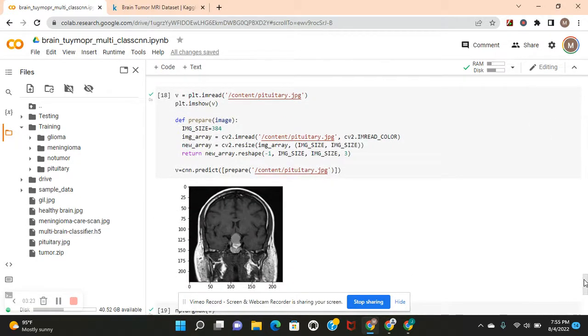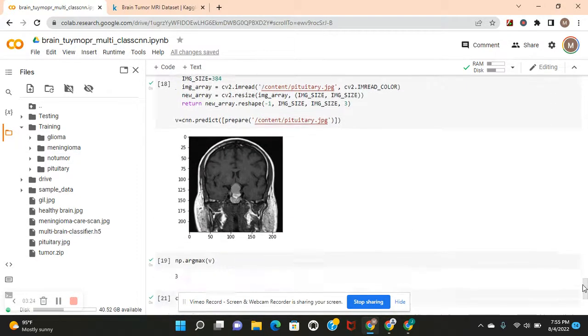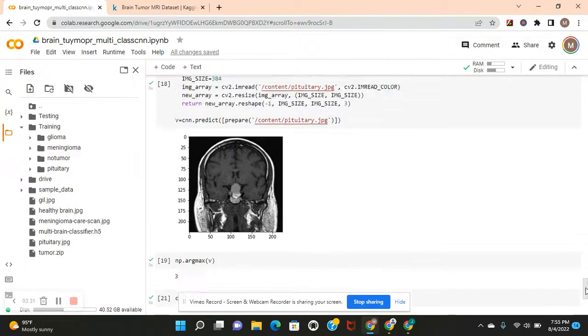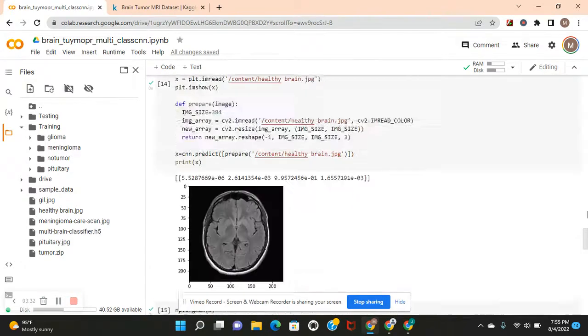We're going to do the same thing for pituitary. That's class label three. Three. And then you guys can save it with .h5, name it whatever you want to save the model.